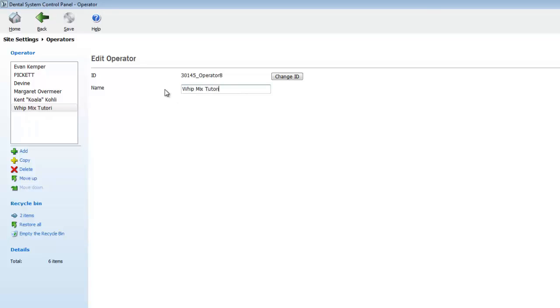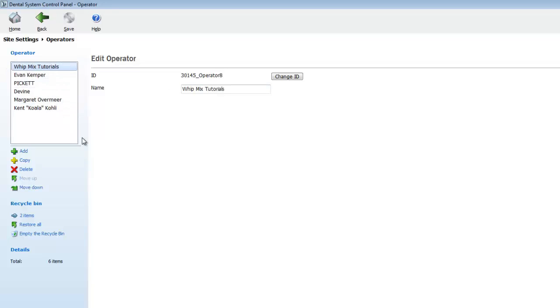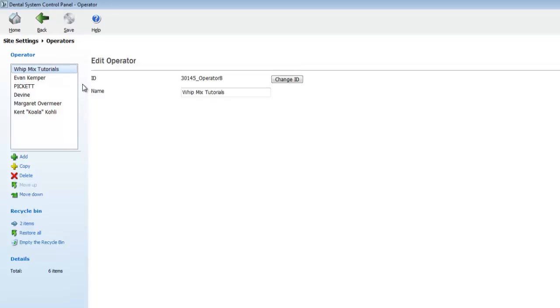To set our operator as the default operator, all we must do is drag it to the top of the list on the left hand side of the screen. Now that we've added our operator to the system, we can exit out of the window.